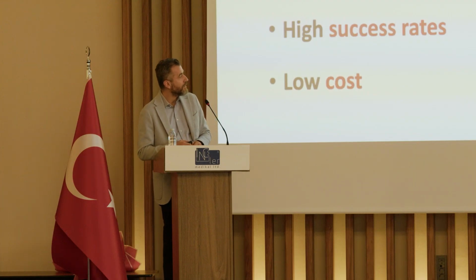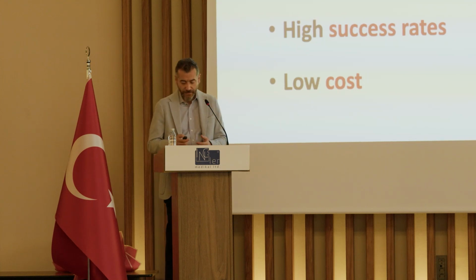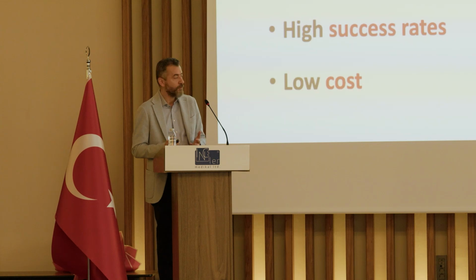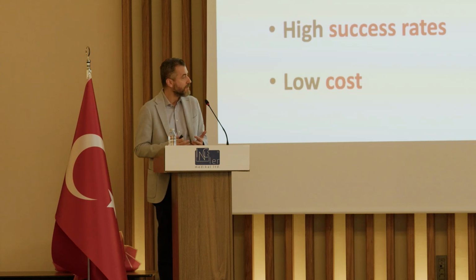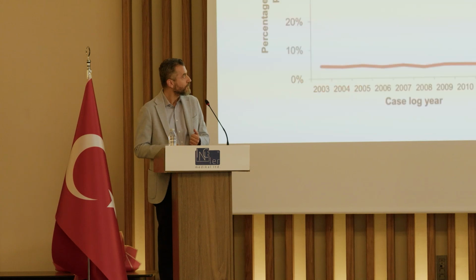However, shockwave lithotripsy is now in the market for more than 40 years. And it has really good treatment outcomes. It's really non-invasive. You don't need an anesthesia for this procedure. You don't need a hospitalization. The complication rates are low, the success rates are high, and the cost is also low for our reimbursement systems, but still, it has a decreased role in our daily practice.